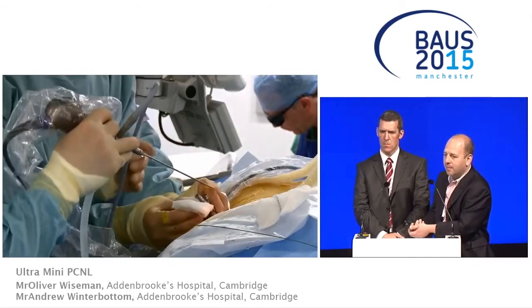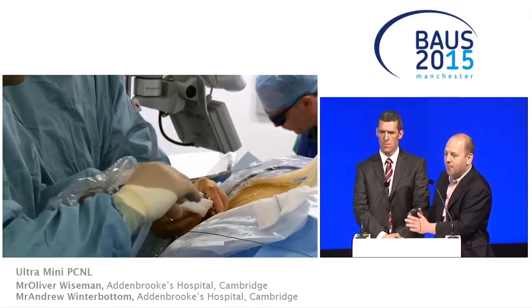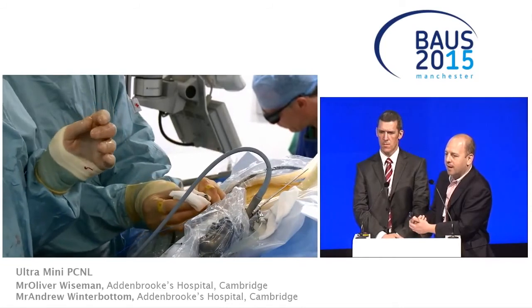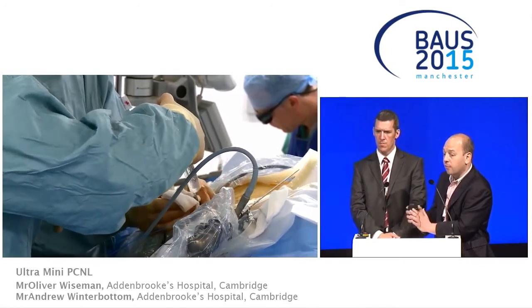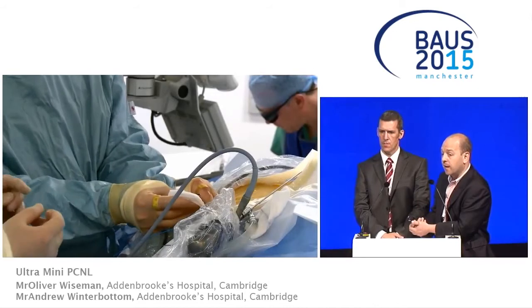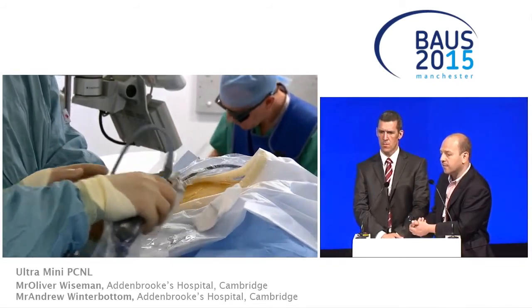sheath, we don't leave a tube, and for me that was quite a big step. I've always left a tube. I've never done a tubeless perk, and so it's kind of small steps at a time. I'm quite conservative, but the 4 cases we've done have all been fine. They've all gone home the next day, so I think if you do them in the morning and they're fine in the afternoon, I don't see any problem. There's no reason that you couldn't send them home the same day.